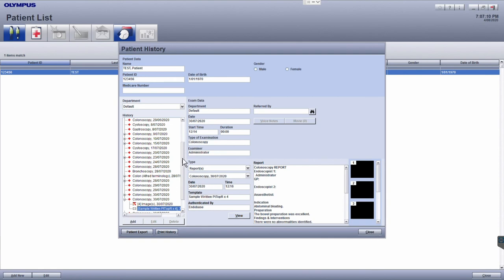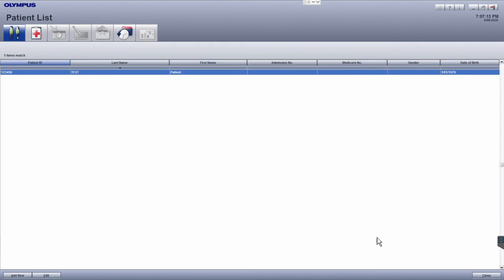After the patient history has been accessed, click the close button to return back to the patient list.